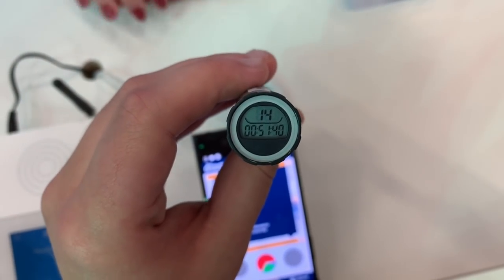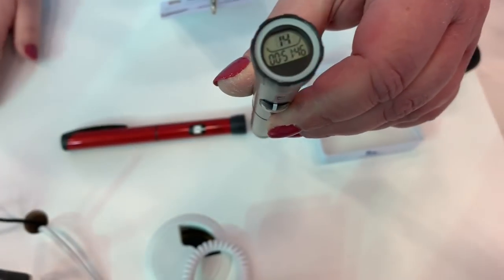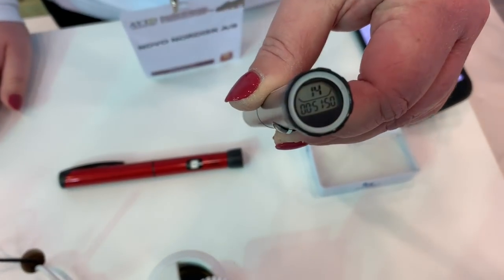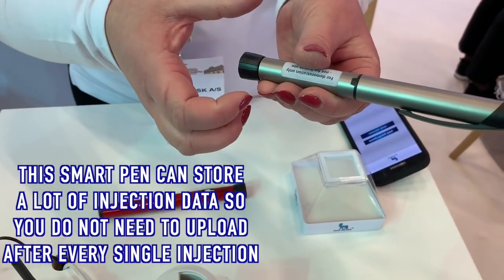The last dose and the amount of that dose. Oh, sorry. Yeah, it was 14 units, and that's the time since the last dose. And to save the battery, it disappears after 10 seconds. And let's just pretend you took your insulin. And you have the latest 800 doses or whatever.